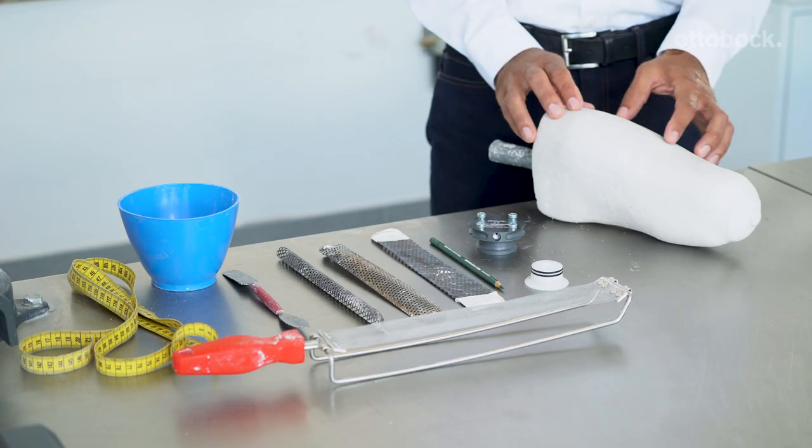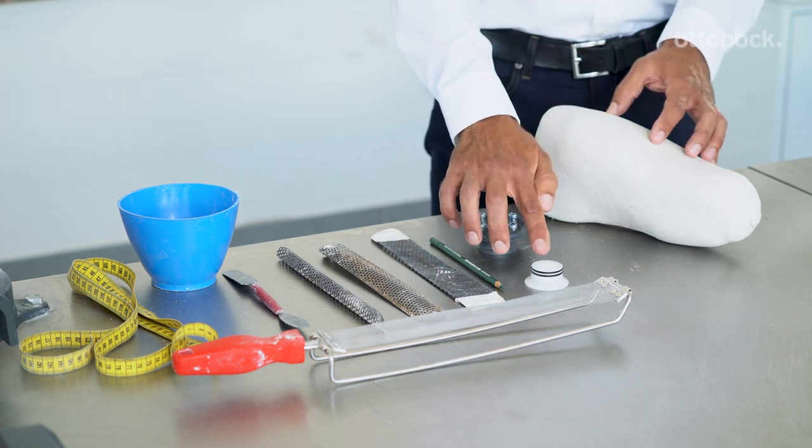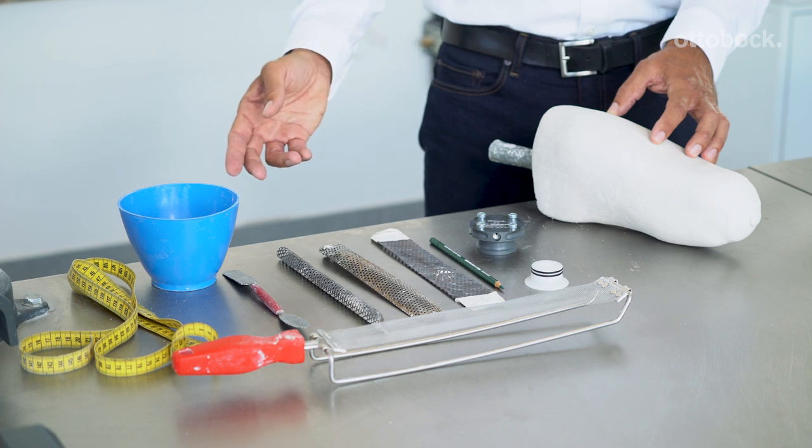The following materials and tools are needed: the plaster cast, the DVS piston dummy, the DVS housing, and the plaster rectification tools.